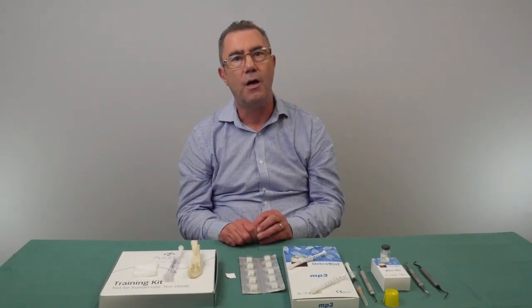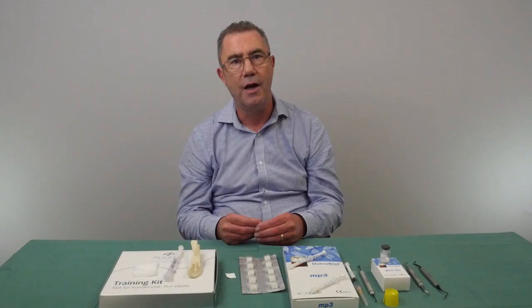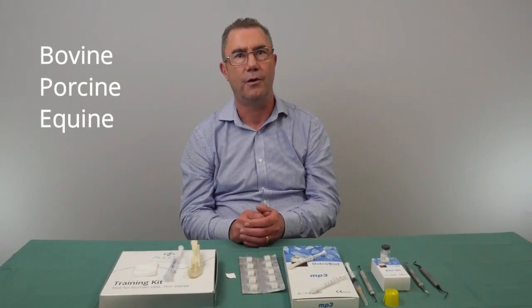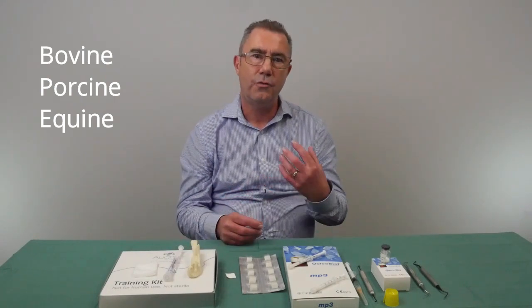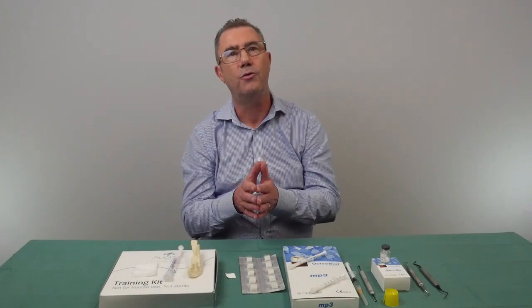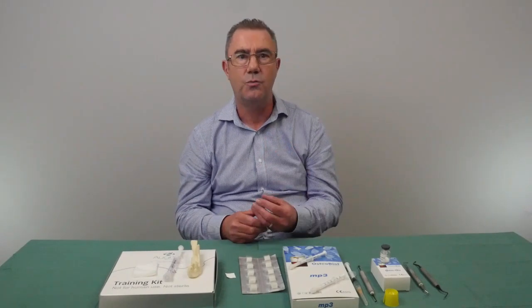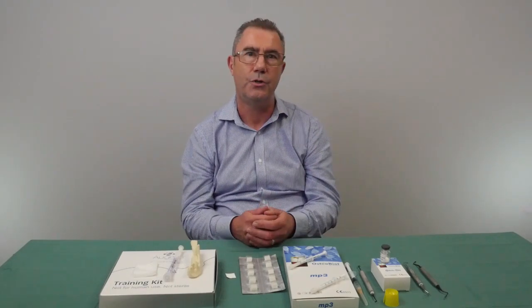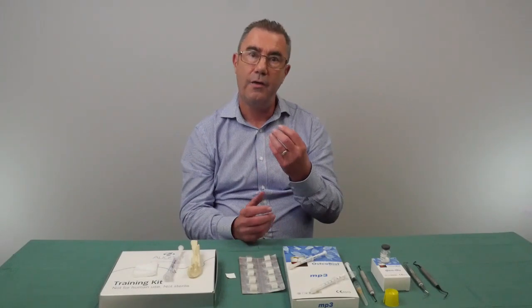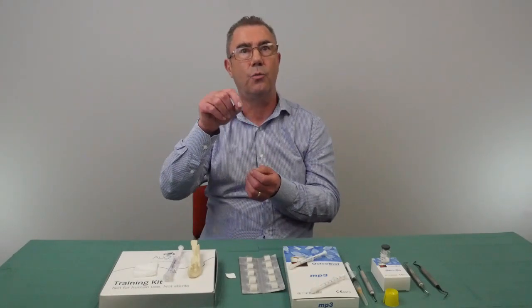Xenograft materials are made from a different species than the recipient, and there are three popular types: bovine (cow-based), porcine (pig-based), and equine (horse-based) materials. This gives you options depending on your own personal preference or those of the patient. The most common bovine material is BioOss. A disadvantage of this material is that during processing it is heated to a very high temperature and becomes ceramicised, meaning it is very hard and will not resorb. You would still find lumps of unreacted material present within the bone 5, 10, or even 15 years later.